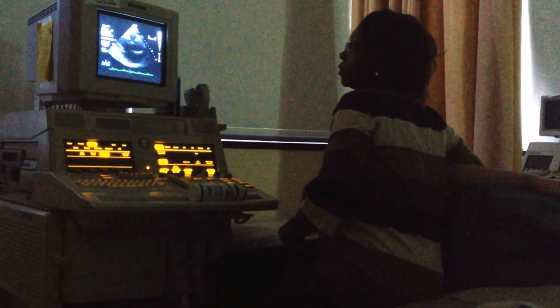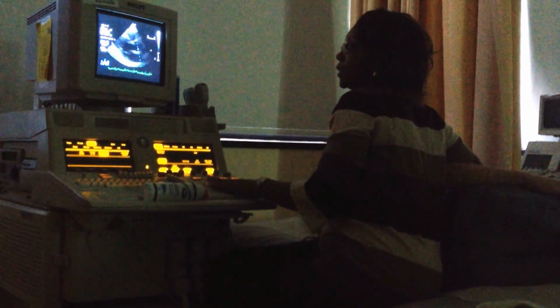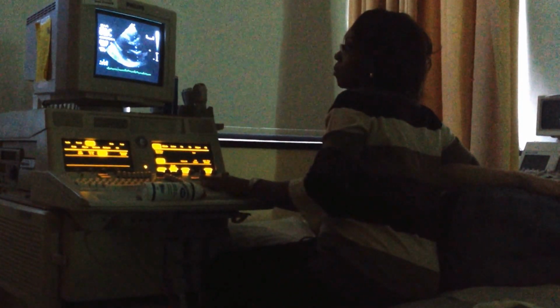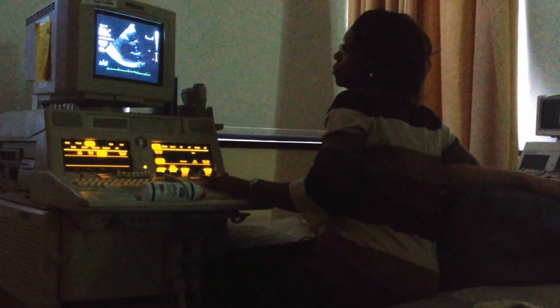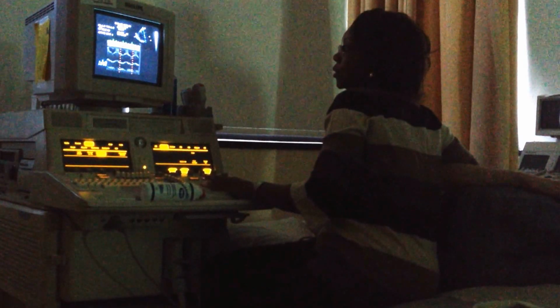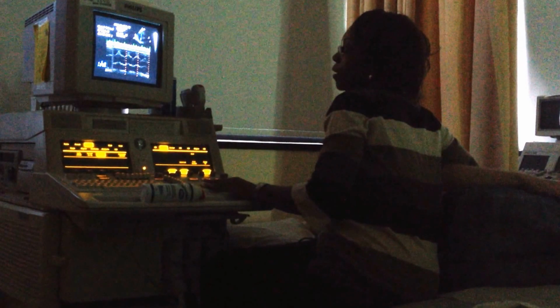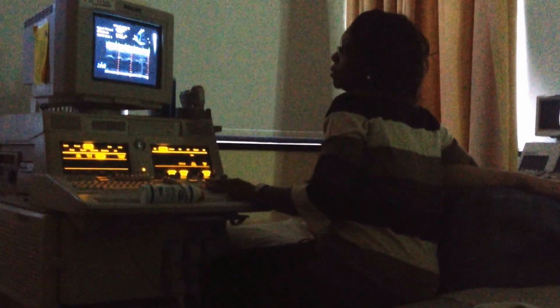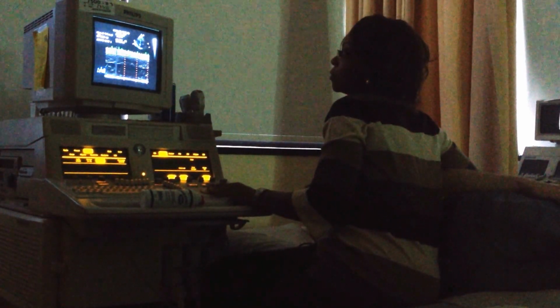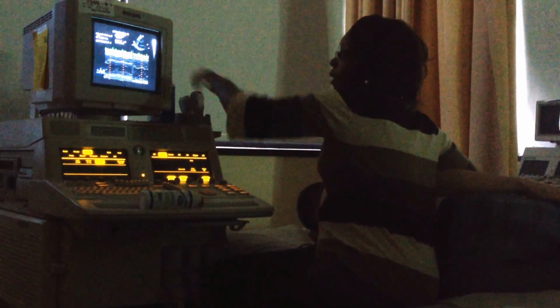So this is my parasternal long. When you're in parasternal long, you want to bring your trackball over. You can start right to left or left to right to sweep. You want to put your little caliper, your little sample, right over your valve area and hit M mode. It's going to draw your couple beats of your aortic valve, come down and sweep over your mitral valve. I'm not moving my transducer, I'm just moving my sample.